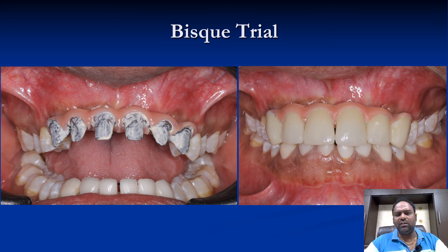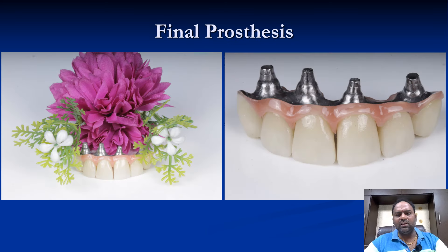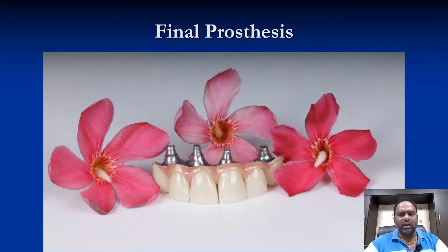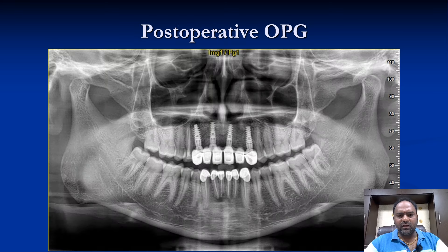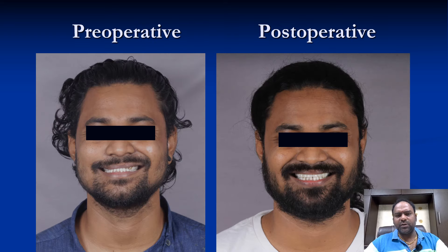This is the final design with the bisque try-in, which the patient liked well. The final prosthesis was made with a titanium bar with individual zirconia crowns. This is how we cemented the zirconia crowns, and this is the post-operative OPG.